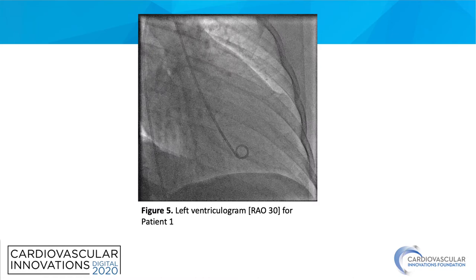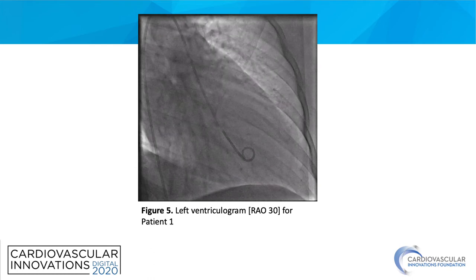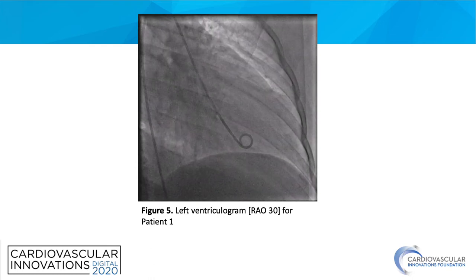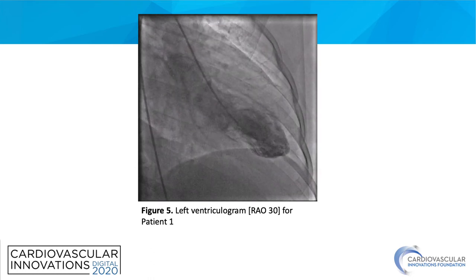A left ventriculogram was also done for patient 1, as seen in figure 5. This patient's left ventriculogram demonstrates severe apical hypokinesis and distal inferior akinesis, with the rest of the walls having normal function. We can see the video for that as well.